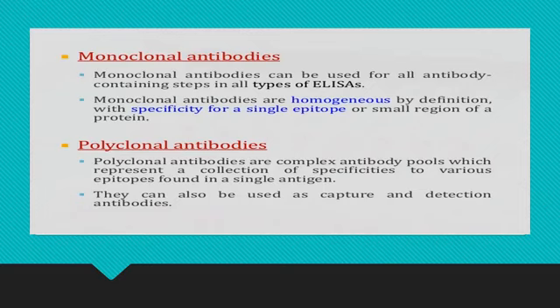They can also be used as capture and detection antibodies. We can use them as secondary antibodies that are enzyme linked, and when we add substrate, they can develop a color if there is an antigen-antibody binding.